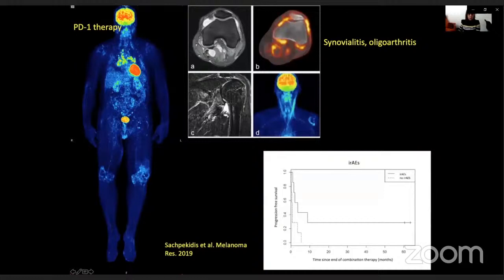This case was confirmed by biopsy, and this is something which is seen relatively often in patients who get anti-PD-1 therapy. So we have to be aware of this symmetrical enhanced FDG uptake in the mediastinum, and we have to be very careful and even do a biopsy and not automatically classify such a case as a progressive disease.